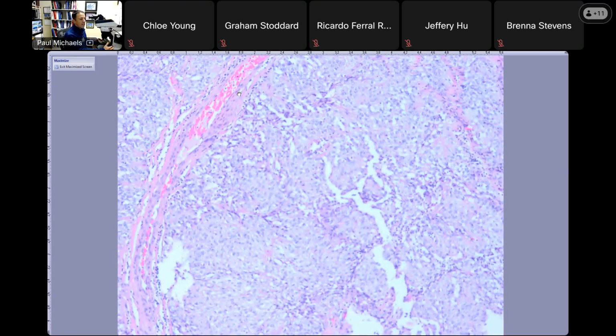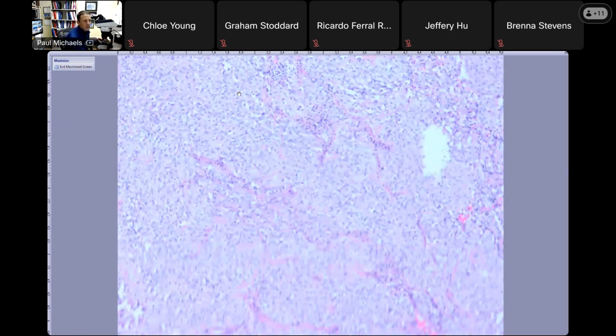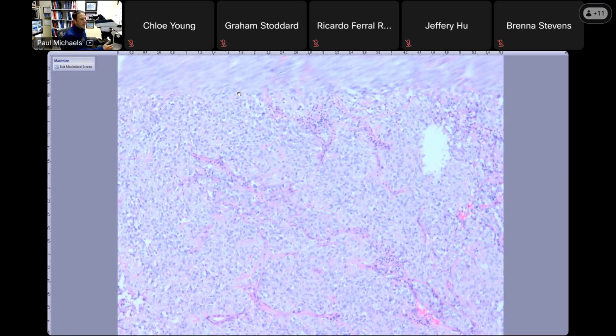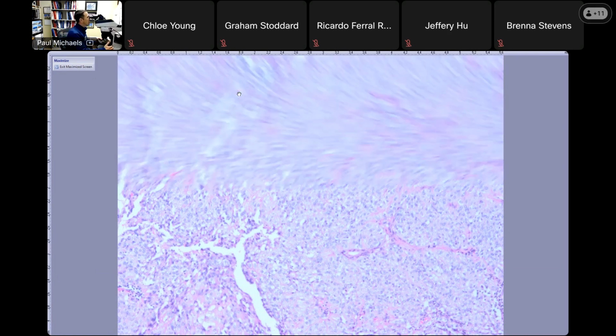So I just thought it was kind of an unusual case. It's funny, though: if you saw this and they said it was a dural mass, you wouldn't think twice. You'd know that this is a meningioma. It's just that context. If you see someone at the checkout at the grocery store all the time, it's easy to identify them. Then you're on vacation somewhere and you see that person in a restaurant, and you think, I know that face, but I don't know where. Anyway, it's kind of the same thing.